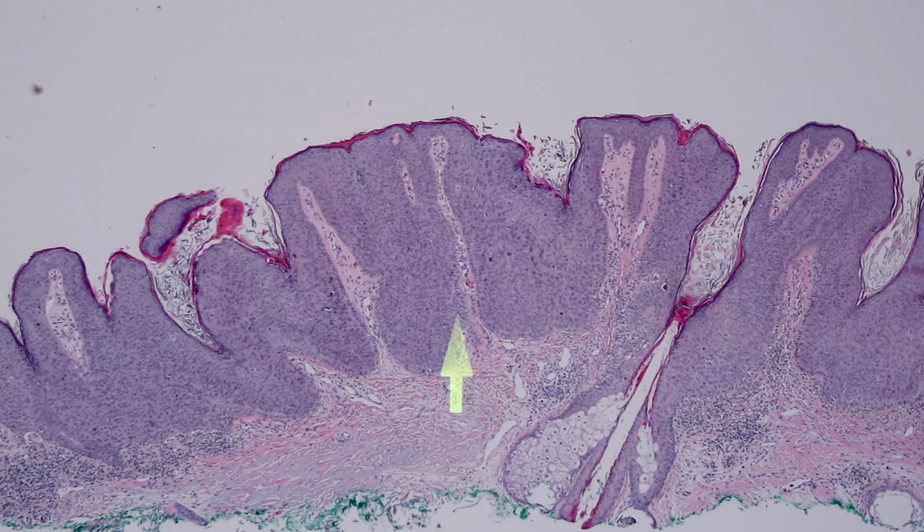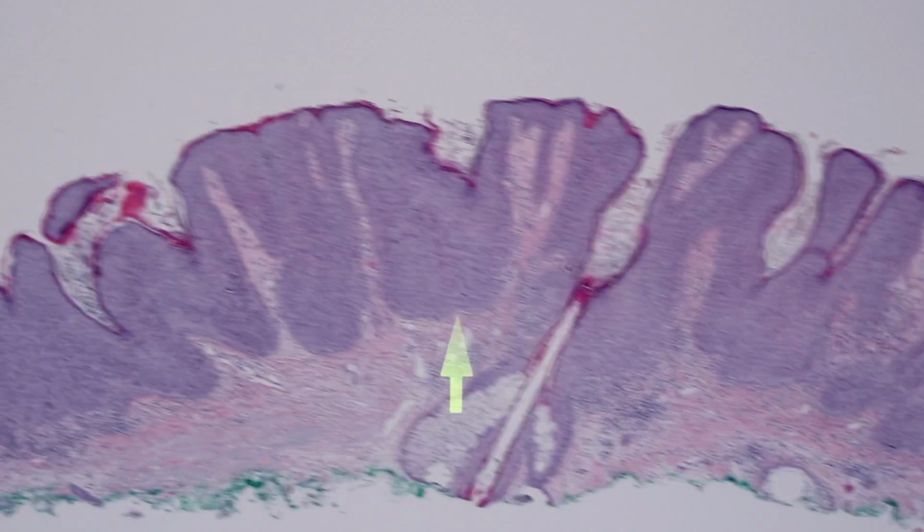And if it's not obviously in the anogenital area, but it's somewhere like, say, inner thigh, where I'm not sure exactly how close it is, sometimes I'll call those squamous cell carcinoma in situ, but I'll put a comment that if this is close to the groin, then maybe it would be better regarded as HSIL. They're the same thing. It's still squam in situ, but the reason is in the anogenital area, it may be treated by a gynecologist or a urologist, and we need to make sure that we use the terminology that they're familiar with. So I think that's the important thing, is making sure you're using the proper terminology for whoever's going to be taking care of the patient.